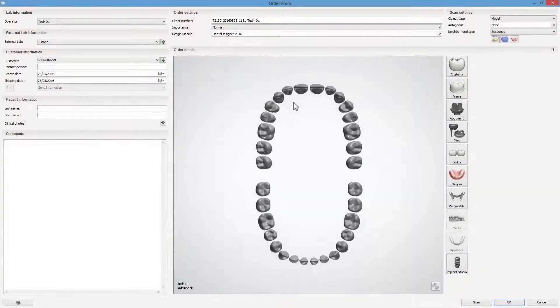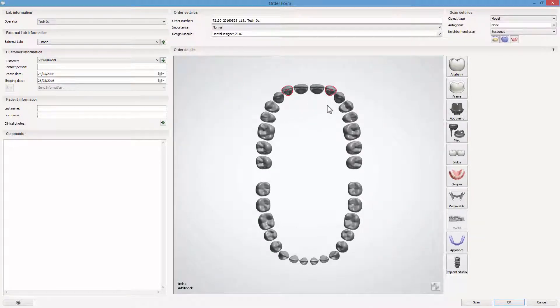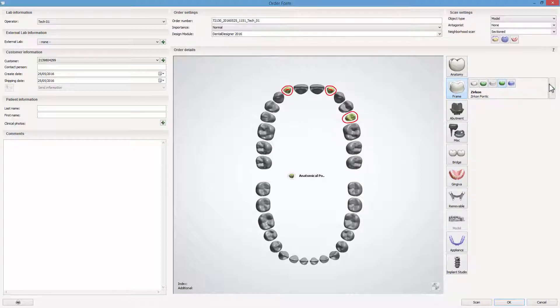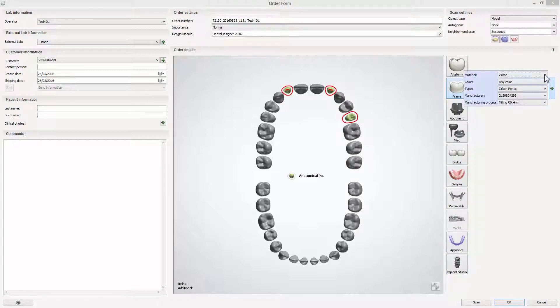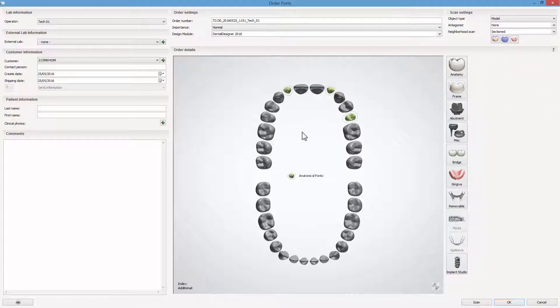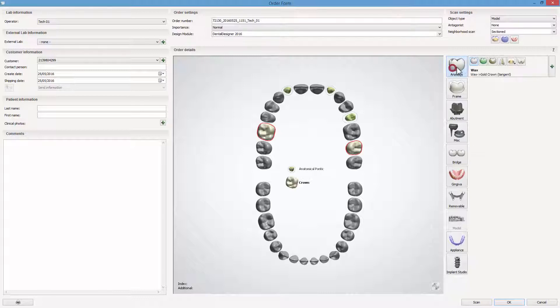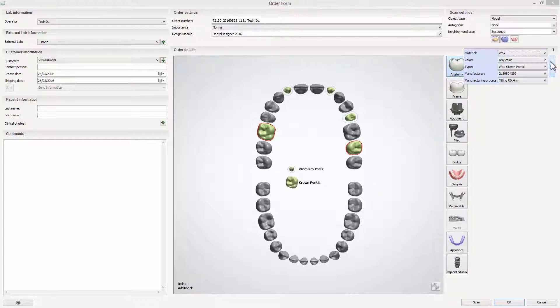As usual, create a new case in the Dental Manager. For our video, we are choosing teeth 12, 22, 25 and Frame Anatomy Pontic, which will create the metal backing. Next, teeth 16, 27 and Anatomy Crown Pontic in order to create metal dummies.